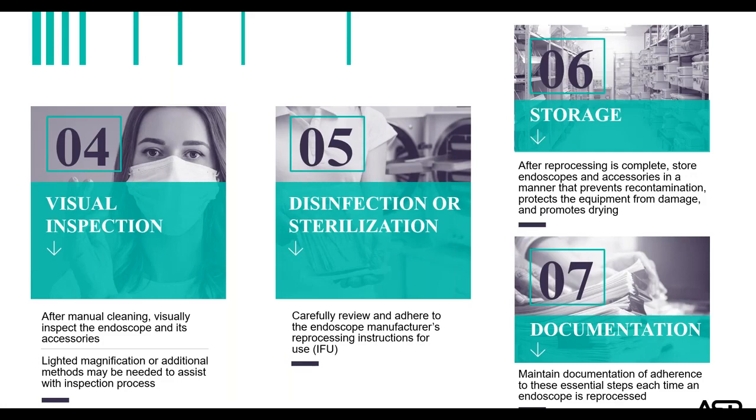Studies have supported the use of flushing alcohol followed by forced air drying as a method to prevent microbial growth in high-level disinfected scopes. And we're not talking about the air you get at Home Depot or Office Depot, that canned air that you clean off your computer. Those all have oils and contaminants in them. And don't laugh, because I actually have seen that. What I am speaking of is instrument air via a tank or a centralized access line or some other source.